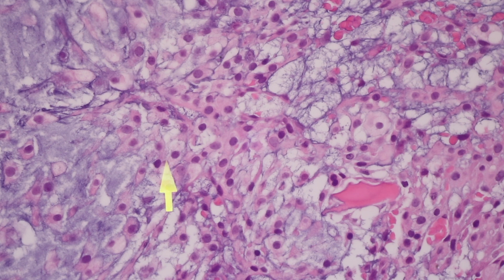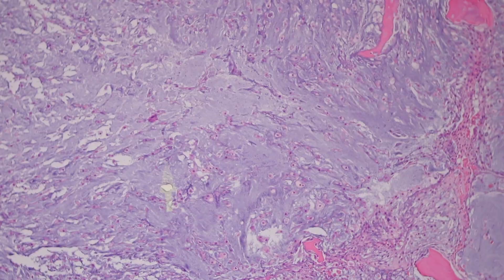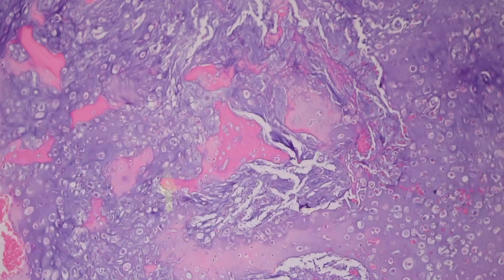So I look at other things. I look at the configuration of the cartilage. In the cartilage we saw, say, in the fracture callus, it is linear. Neoplastic cartilage is globular or round. So here's where the clinical and radiographic and overall context come in. And low power, looking at configuration of the cartilage. Also, fracture callus cartilage undergoes enchondral ossification. Here, we're not seeing any enchondral ossification. Right. So those would be some features I would say, no way is this fracture callus. This has to be chondrosarcoma.